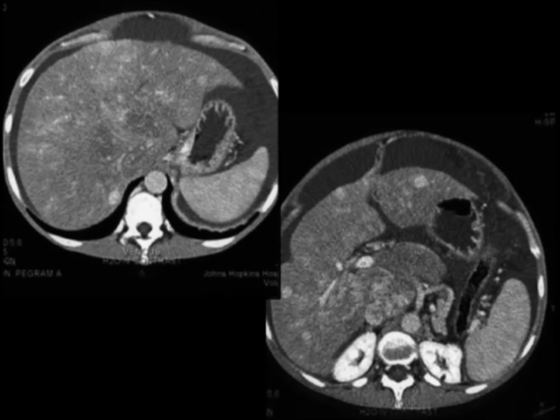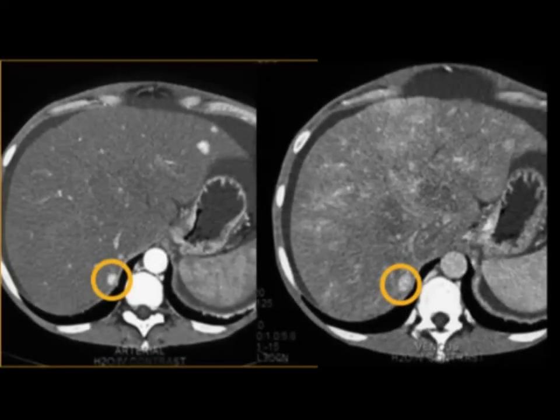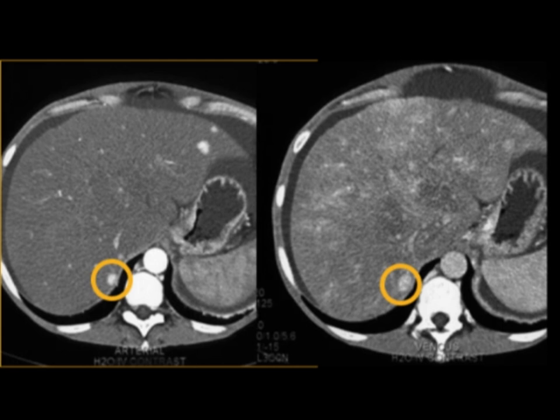One of the interesting things I found with regenerating nodules is sometimes they're easier to see on venous phase imaging. And the other interesting thing is you go from arterial to venous, the lesions sometimes get larger — they expand. Lesions typically do not get larger in the liver. Lesions become isodense with time, or become the same size or smaller, but they never get larger. The only thing I've ever seen get larger is regenerating nodules.